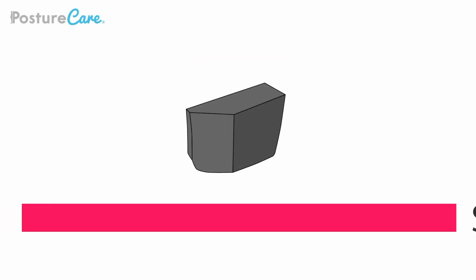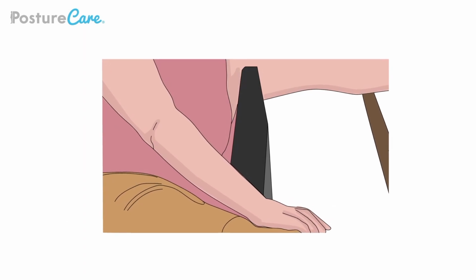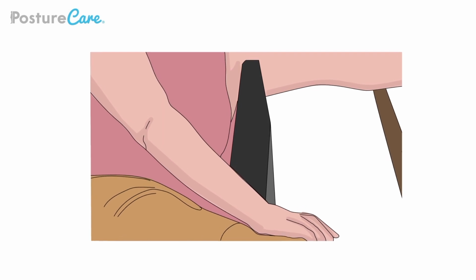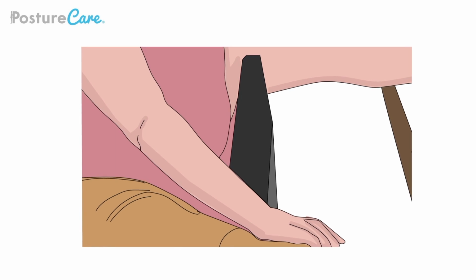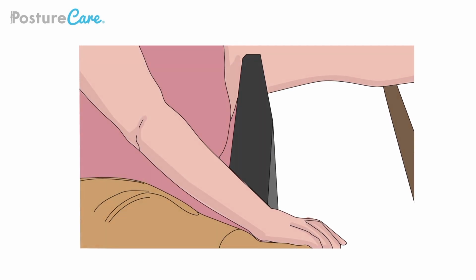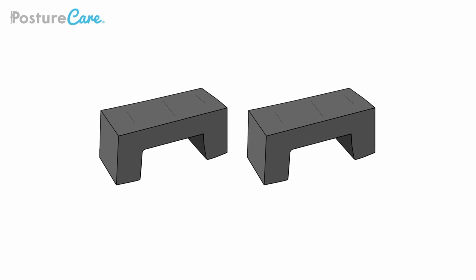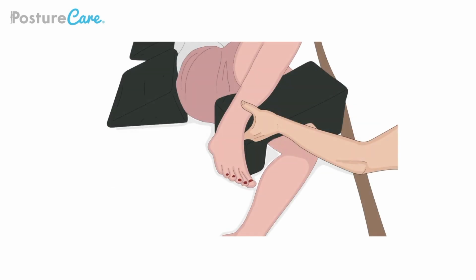Anterior support. Thorax support. For extra comfort and support, place one of the thorax supports in front of the patient at their stomach to chest area. This will also act as a cushion for the patient to cradle, allowing them to feel safer in bed. Supporting the lower limbs is achieved with two specially designed bridge supports. As their name suggests, they will help to aid and separate the legs whilst employing much needed support.